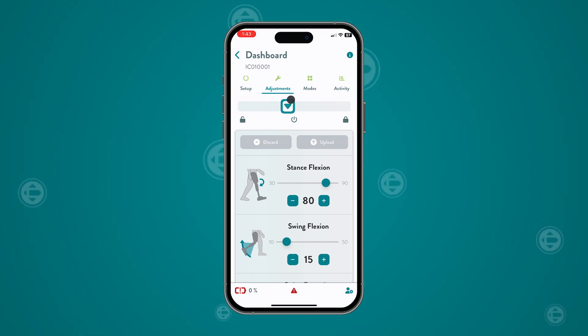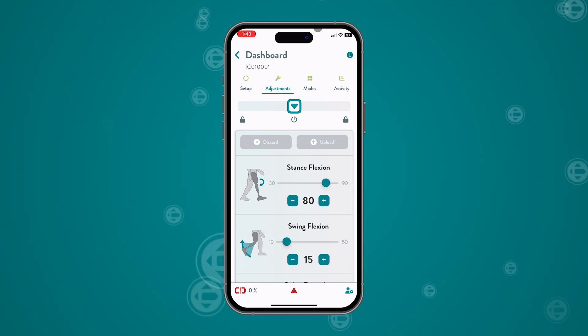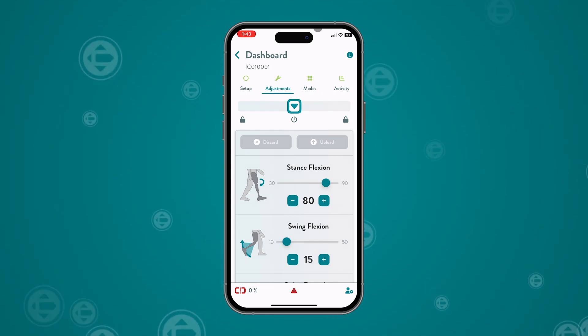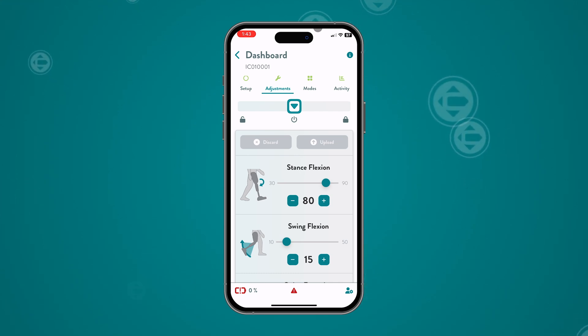Sliding the arrow to the right will engage the flexion lock, while sliding the arrow to the left will engage free swing mode. An alert will appear each time the slider is moved. Prosthetists should never change the knee to free swing mode without first notifying the end user.